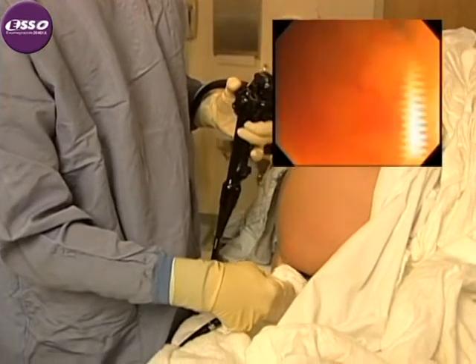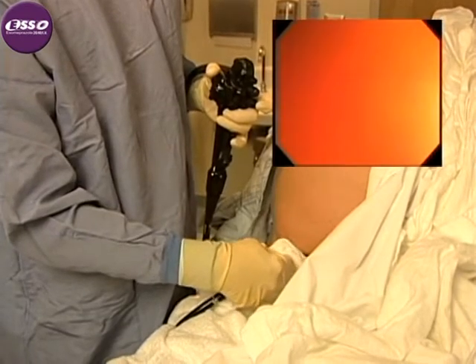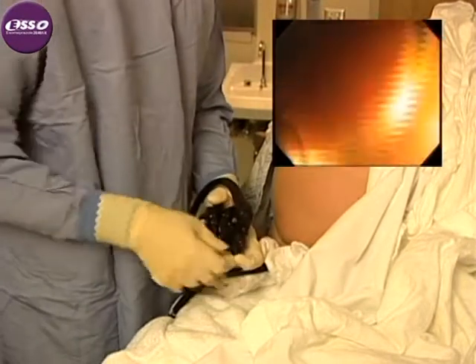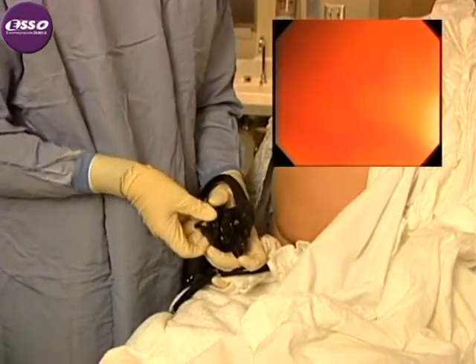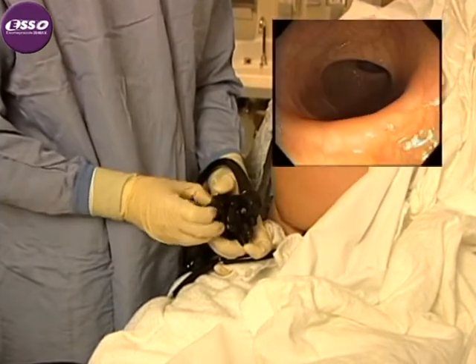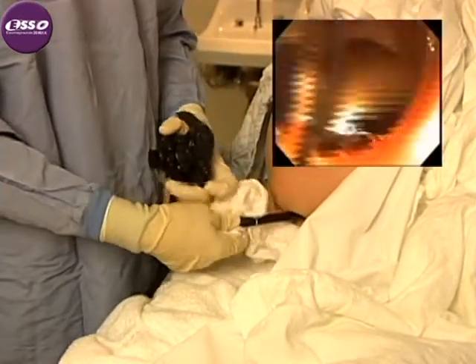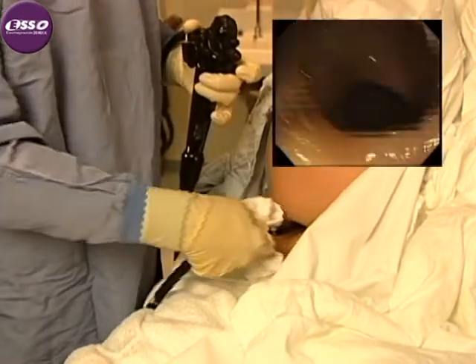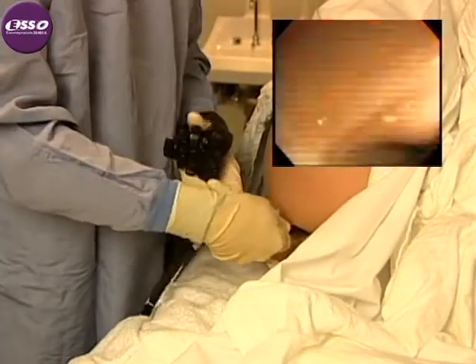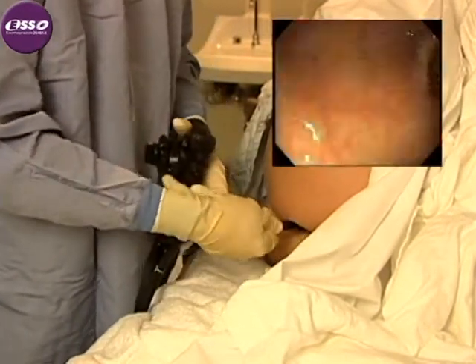Here is the real-time demonstration. We see the colonoscope tip passing through a turn in the sigmoid colon using what is known as the slide-by maneuver, which will be discussed later. Notice that the up-down control has been deflected maximally in the up direction, but by stopping and using the left-hand shaft grip and turning the right-left control toward the left, the lumen is brought into view. This hairpin maneuver is critical during retroflexed examination, and as we just discussed, it can be extremely useful in passing sharp turns during insertion.